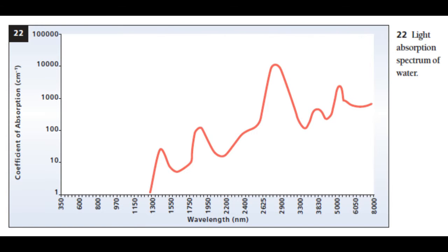In the study by Pathankar et al., thermal coagulation of the sebaceous lobule was demonstrated in rabbit and human skin immediately following laser irradiation. Biopsies obtained from human subjects at 2 and 6 months following treatment, however, showed normal sebaceous glands and ducts, suggesting eventual regeneration of these structures.